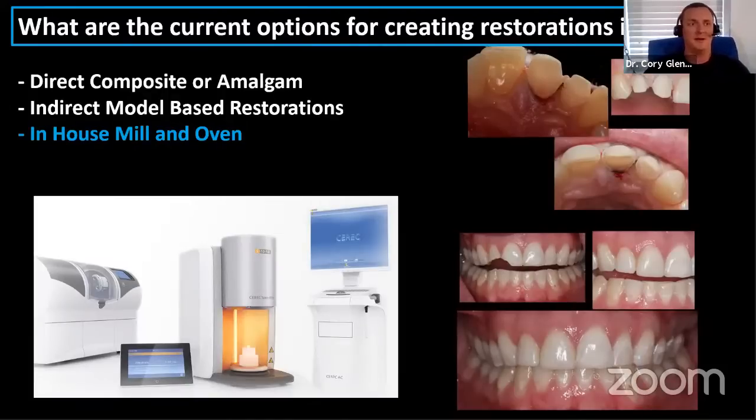That would only come into play with a cost when you're doing surgical guides, ortho, dentures, that kind of thing. So it's hard to beat free on the price. And then it would go from that into your $40,000 mill, which again is a commercial lab mill. You know, it will do anything you throw at it. And then a sintering oven for $10,000.